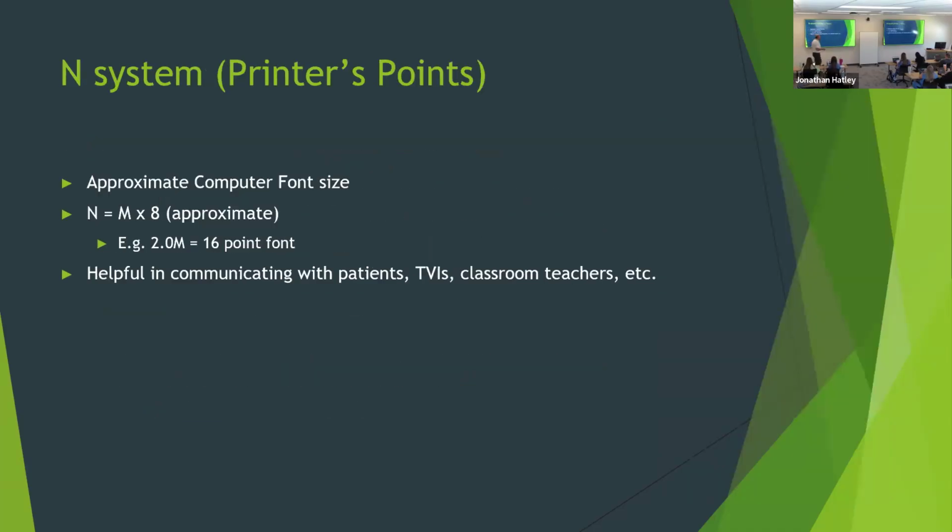The takeaway point with this is, again, don't use the reduced Snellen card for your near acuities, especially in low vision. If you're going to do it in primary care, then you really need to have it at 40 centimeters, and don't let the patient bring it closer, even if they're wearing a +3 add or something like that. If they are doing something, then you're just going to have to get a different chart. It's sort of the long and short of it.